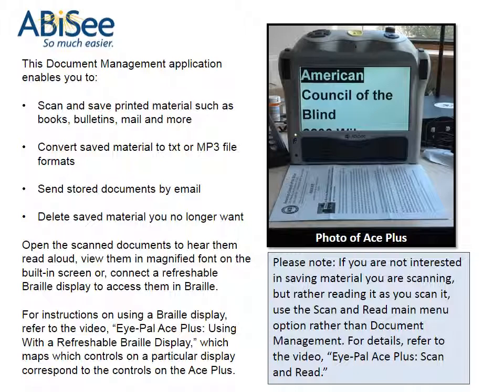Please note: if you are not interested in saving material you are scanning, but rather reading it as you scan it, use the scan and read main menu option rather than document management. For details, refer to the video iPal Ace Plus: Scan and Read.